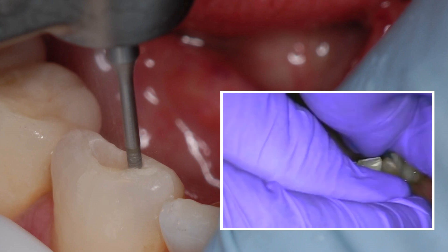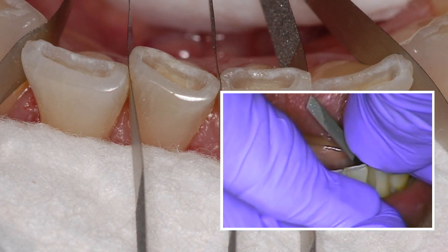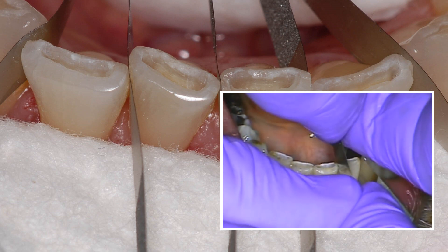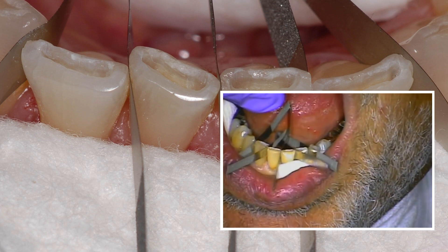That's it. You can see now I've got the preps finished. I'm isolating with whatever you want to isolate with — I use metal strips, you can use Teflon, anything that's thin enough to get in there.